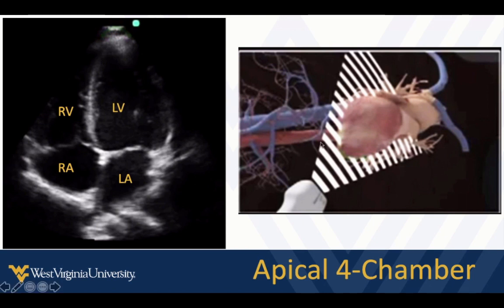Here you can see a cross-section of what we're doing with the beam, and then we get this upside-down image of the heart with the apex at the top of the screen. The base is back here, the right side is over here, and the left side is over here. So if you get disoriented, just ask yourself: where's the apex, where's the base, where's right, where's left?